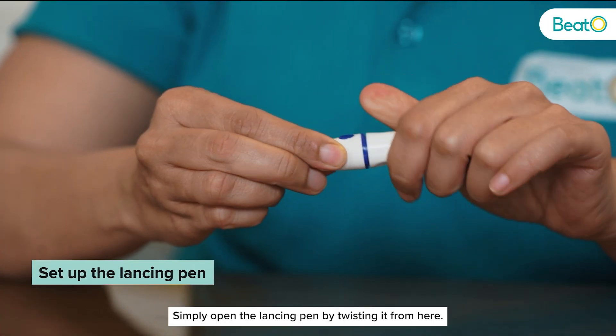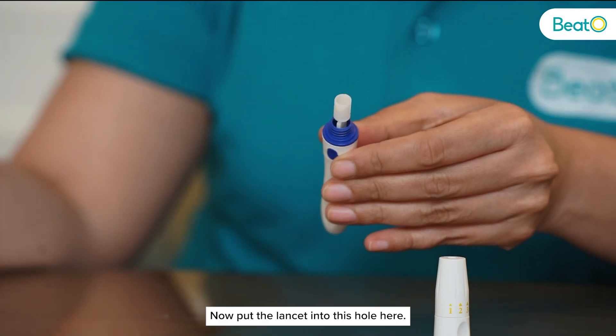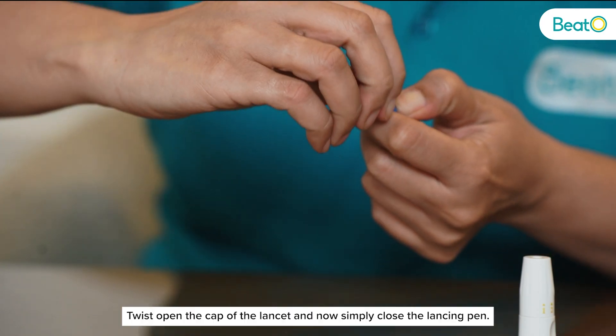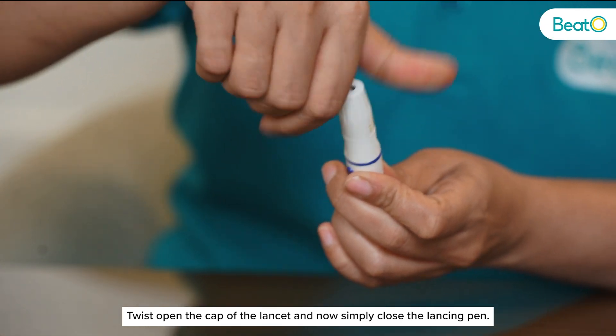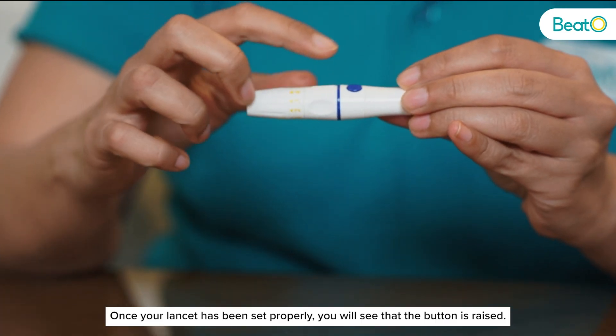Set up the lancing pen. Simply open the lancing pen by twisting it from here. Now put the lancet into this hole here. Twist open the cap of the lancet and then simply close the lancing pen. Once your lancet has been set properly you will see that the button is raised.